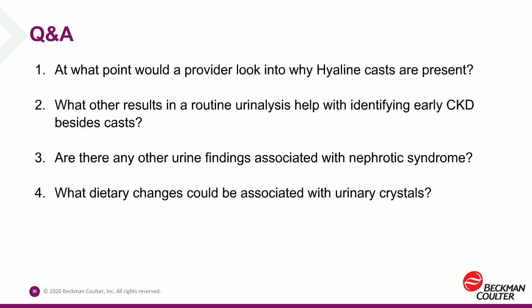Thank you, Don. A provider is going to look into any type of cast, including hyaline. It's important to note casts are not diagnostic, but simply a red flag to a physician that increases the physician's index of suspicion of underlying pathology. So the presence of casts prompts the physician to order further tests and initiate a medical workup in order to definitively identify the underlying cause of the presence of the cast.